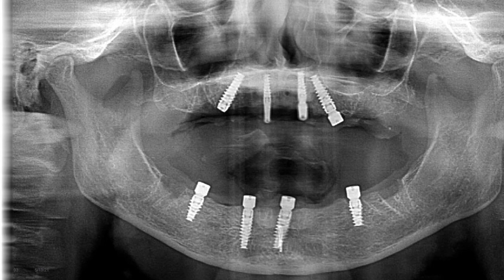There's the final result. AP spread's perfect. The upper and lower all on 4 here. In this case, she had enough reduction. These actually could be straight. I was doing this with a prosthetist who likes to do their own conversion later on. They don't want to do the conversion that day, so you don't always have to convert the same day. It could save a little lab cost as well. But again, this is the latest and greatest.